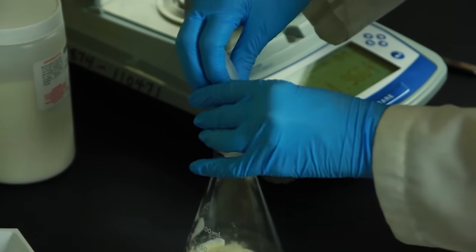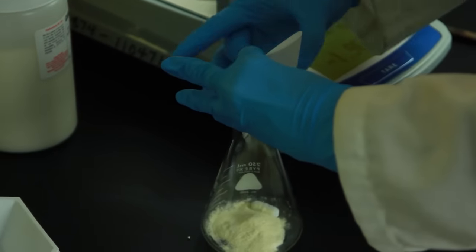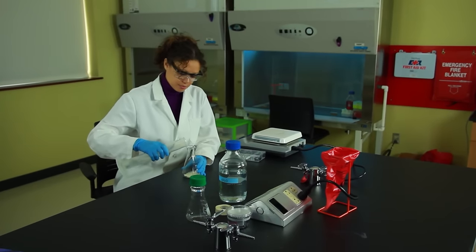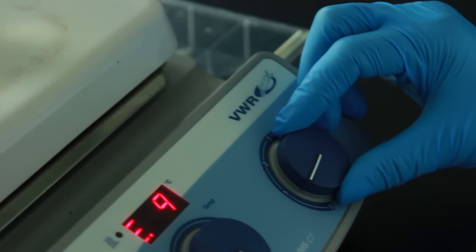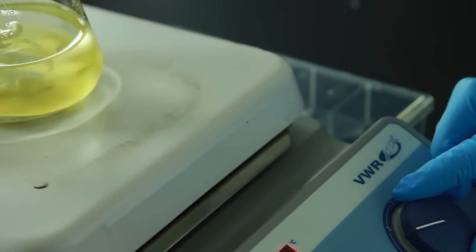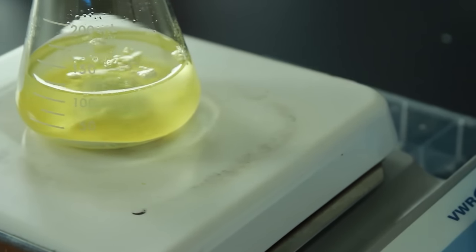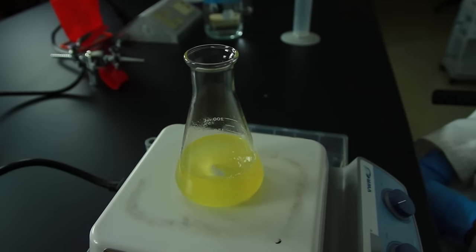Now add the powder to the flask. Add about 75 milliliters of deionized water. Place the flask onto a stir plate. If you're using a combination hot plate and stir plate, be sure that the heat is turned off.